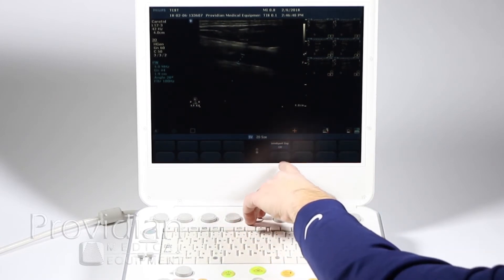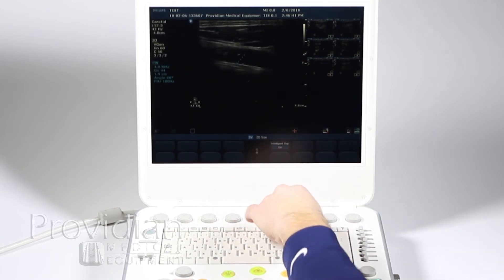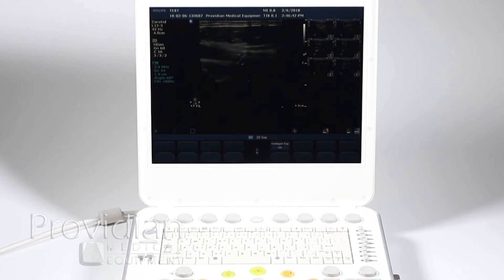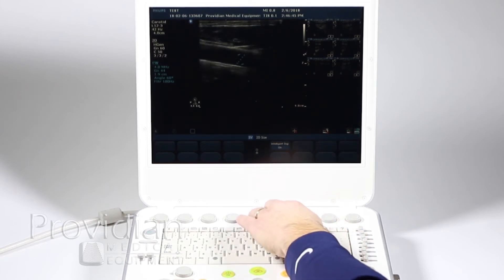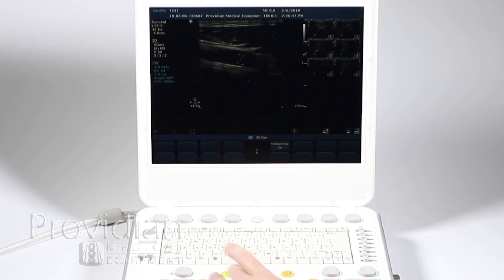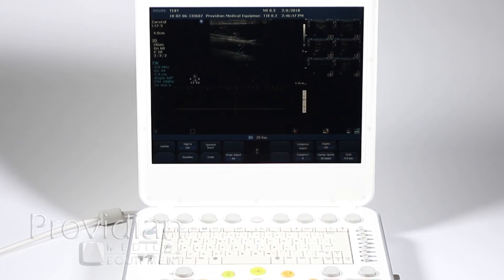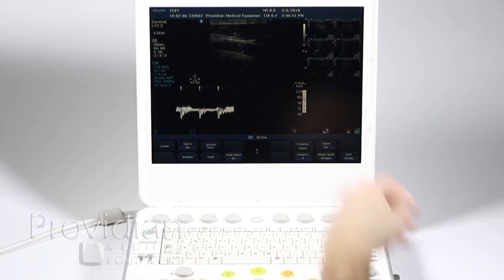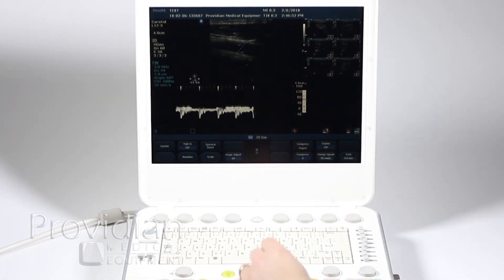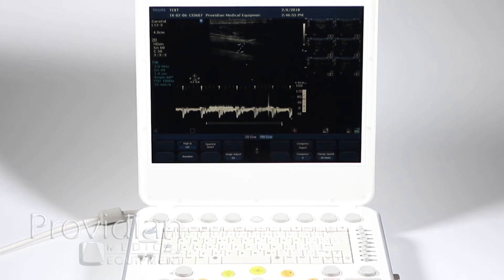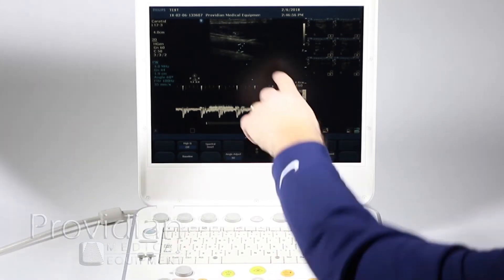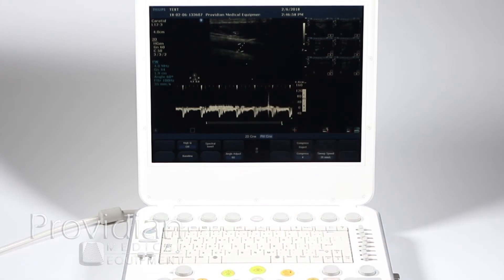Go to Next, and we have Intelligent Doppler, which is going to just try and assume it knows what you're doing. So we turn that on and hit Pulse Wave Doppler. My angle's all messed up, so that angle's obviously not correct and I'm not getting the correct flow there.